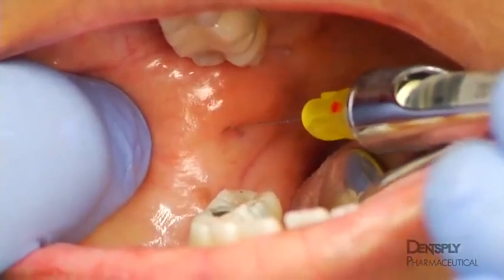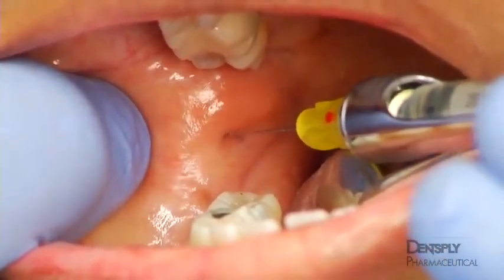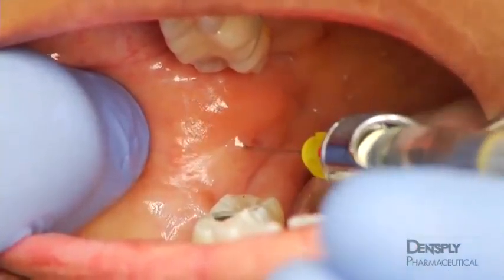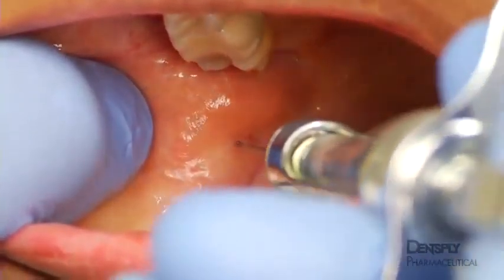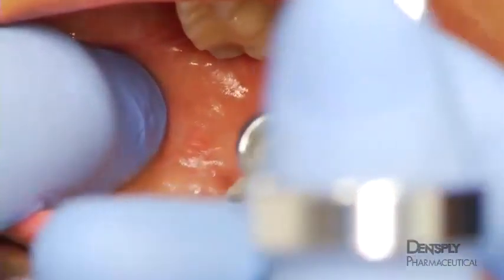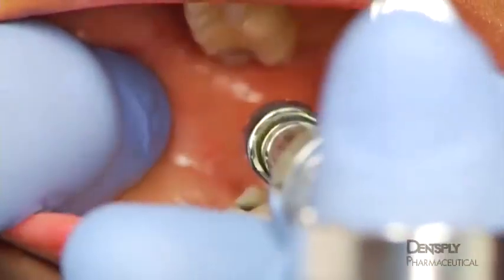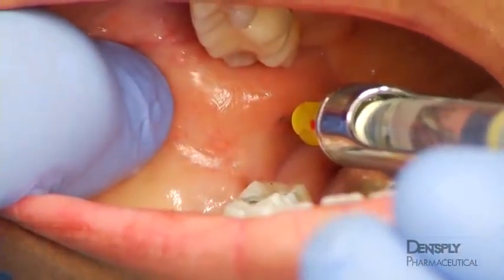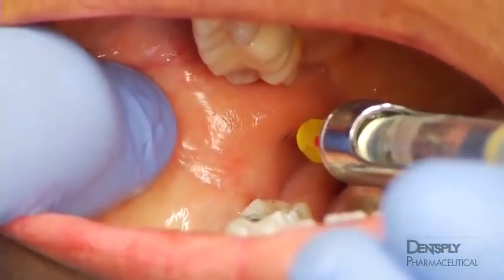Regardless of cause, the needle tip strikes bone too anteriorly on the ramus and must be repositioned. The needle is partially withdrawn, the barrel is brought medially, and the needle is reinserted along the new path. Once past the obstruction, the syringe can be repositioned to its original orientation.